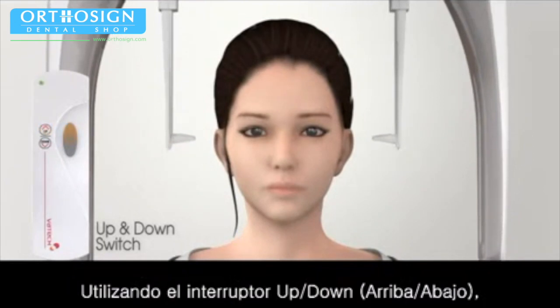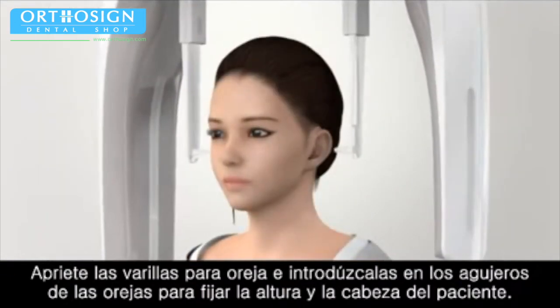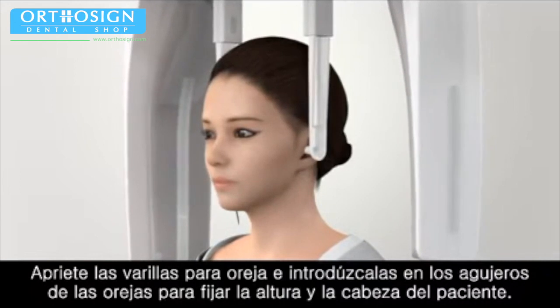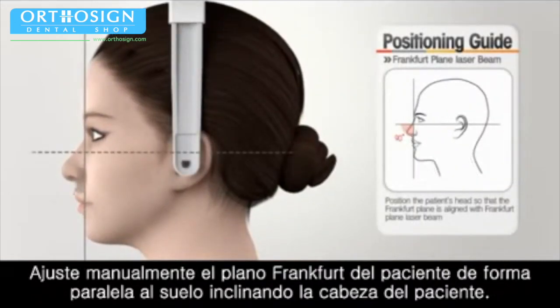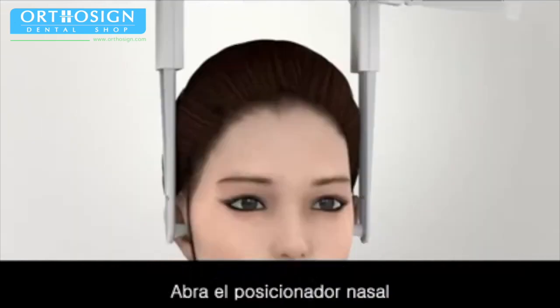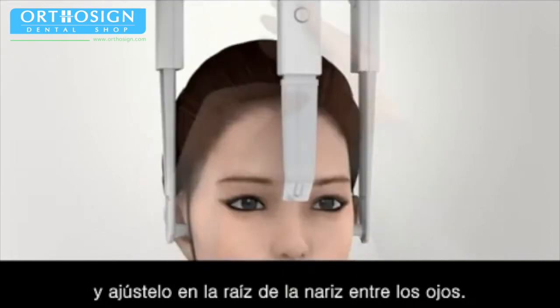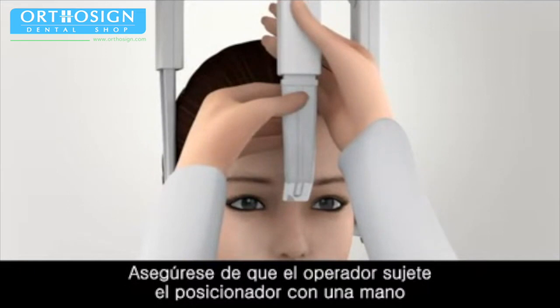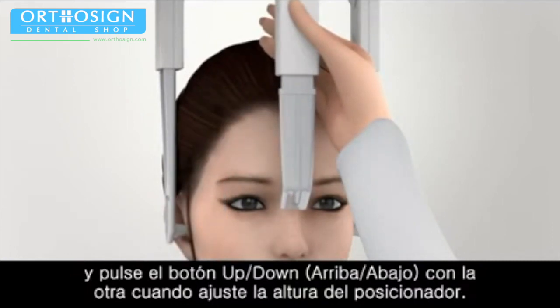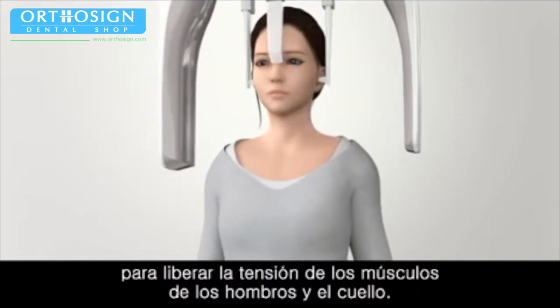Guide the patient into the Ceph unit and place the patient's head between the ear rods. Using the up-down switch, position the ear rod at the exact patient's ear holes level. Tighten the ear rods and insert them into the ear holes to hold and fix the patient's head and height. Adjust the patient's Frankfurt plane at a level with the floor by manually tilting the patient's head. Unfold the nasal positioner down and set it at the root of the nose between the eyes. Make sure the operator keeps holding the positioner in one hand and presses the up-down button with the other hand when adjusting the height of the positioner. Ask the patient to stand straight up in a comfortable position to release the tension in shoulder and neck muscles.